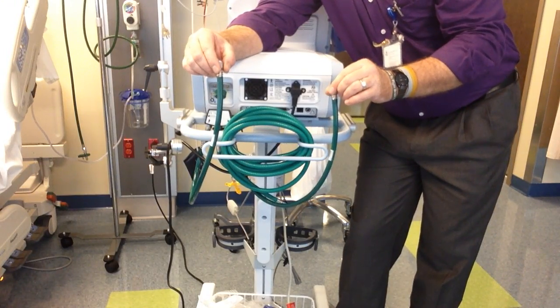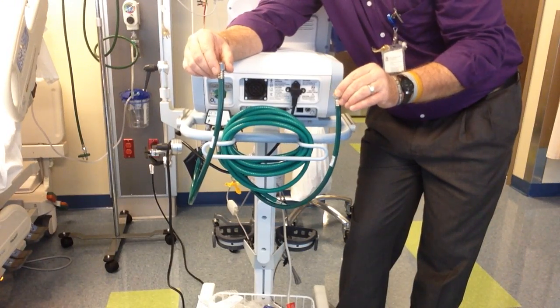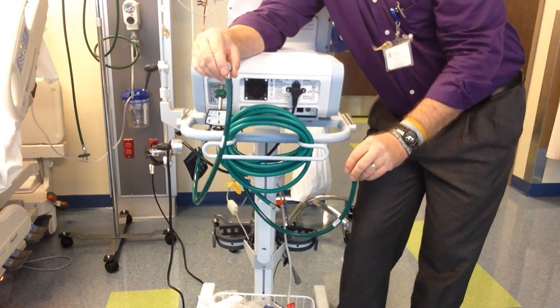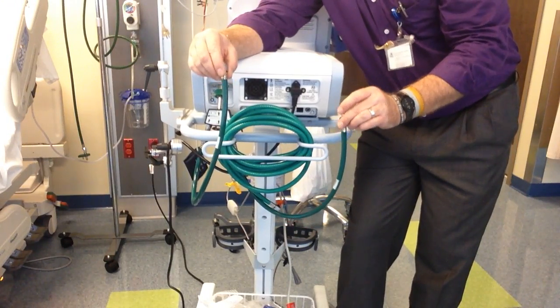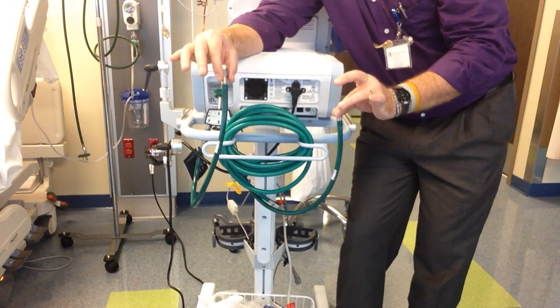patient. If your patient is on a lower FiO2, like 50%, 40%, something like that, you could get by with one tank, run it dry, then hook up your second tank. If your patient is breathing hard and on a high FiO2, to meet the inspiratory demand with 100% FiO2, you will need both tanks. This is for transport.